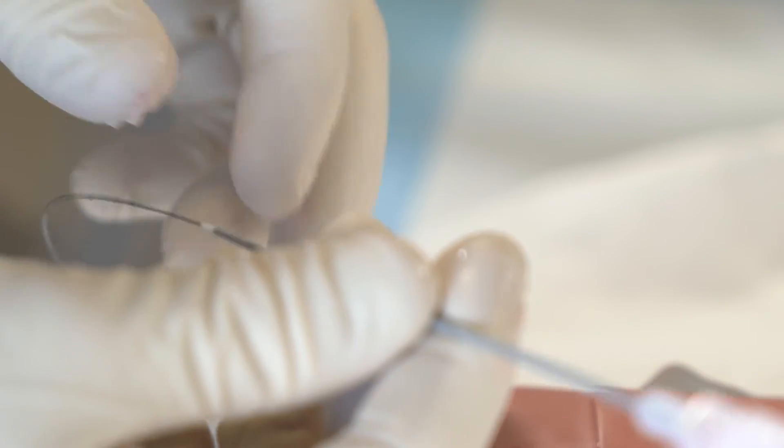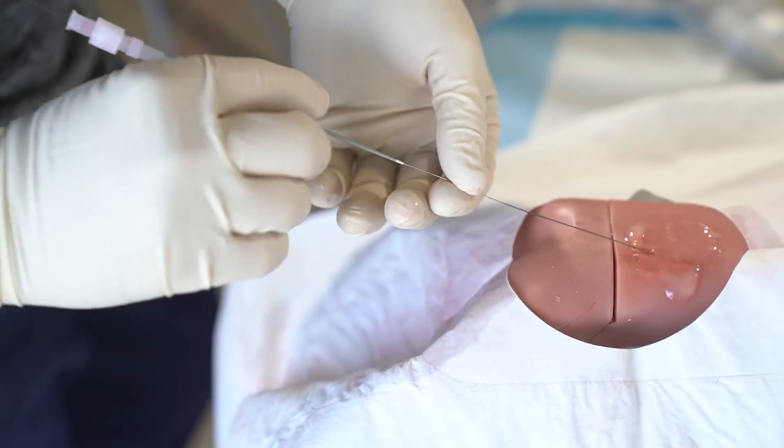Now thread the catheter over the wire with a slight twisting motion as it is inserted.